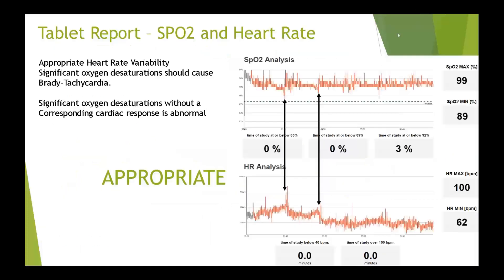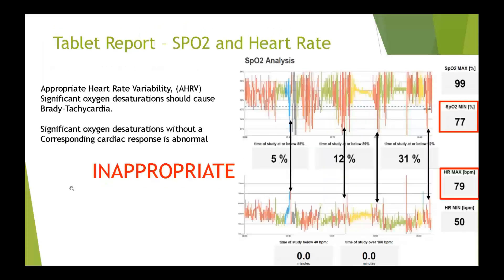Now we're going to look at the heart rate and SpO2 graphs together to make sure we're seeing what we'd expect, and to rule out any possible signs of comorbidities. On the SpO2 analysis there's a deSat or two, and if you follow the black arrow giving you a timeline, you'll see an increase in heart rate at that point. You want to see the heart rate respond appropriately to an oxygen desaturation — that is a normal response.